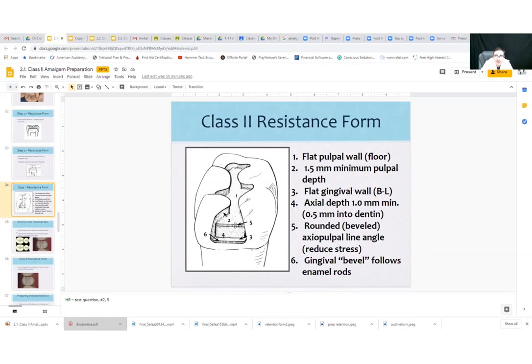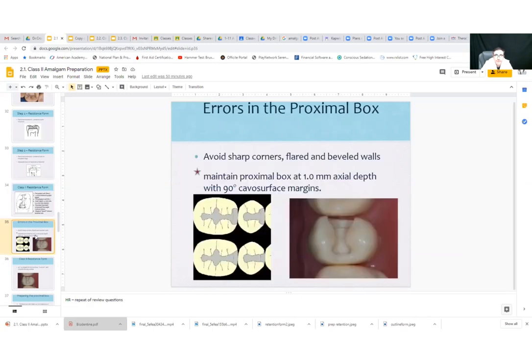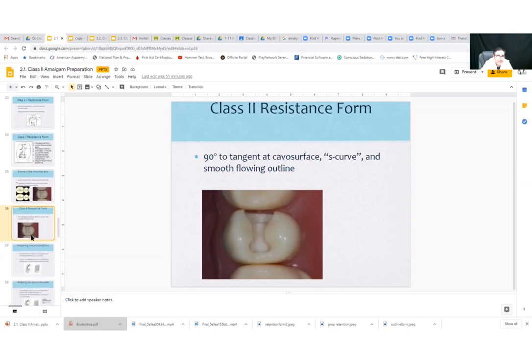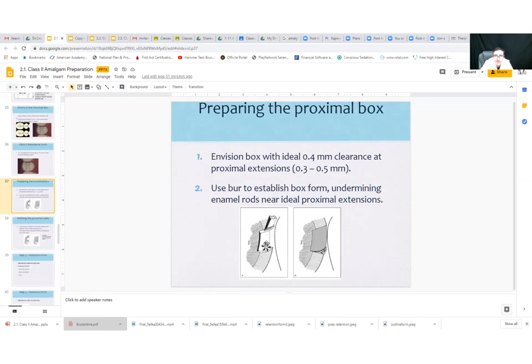Smoothing and beveling the axial-pulpal line angle as well as the gingival here — for this area use that gingival trimmer, you can use it here as well. Avoiding sharp corners; you want everything flowing and smooth. The only place you want that 90-degree angle is at the exit angle. About the S-curve and the smooth outline — once you use that 245 bur to drop that box, you can use that enamel hatchet again to smooth everything out. You don't want anything unsupported or too angled that can cause a future fracture of the enamel.